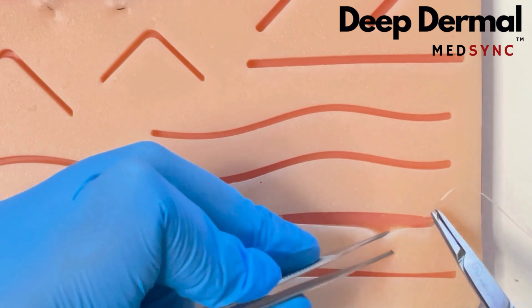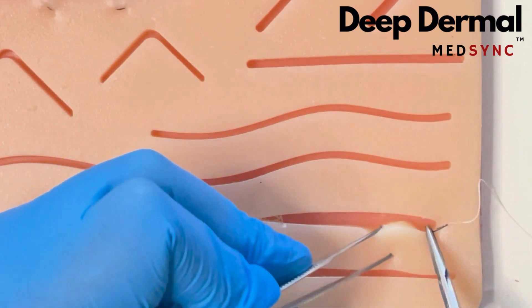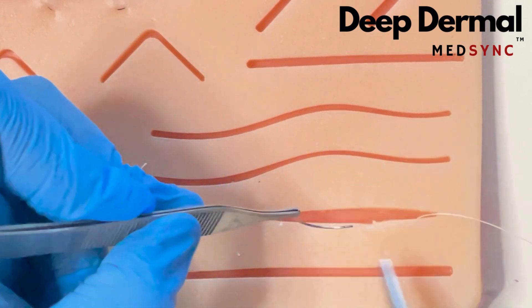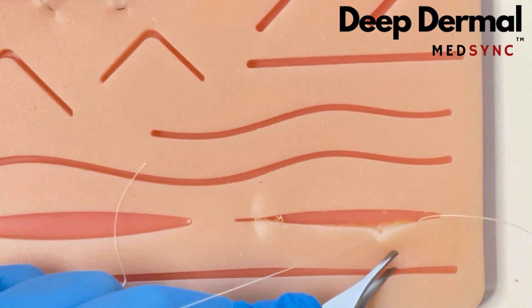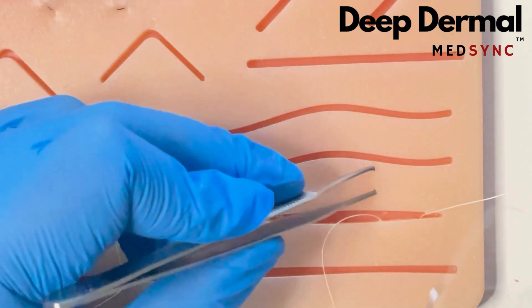The Deep Dermal. This technique buries the knot once it is tied. You start deep and exit superficial on one side.